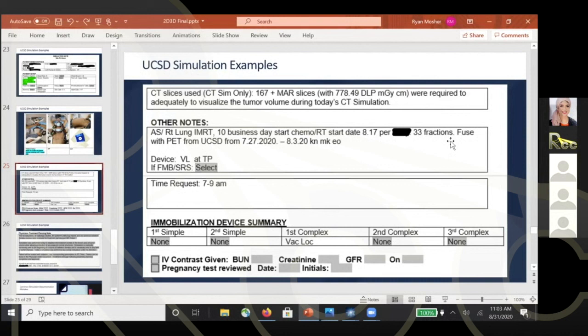So every patient that comes in for radiation treatment has to have a CT scan, unless they're an electron patient. If the patient wants, or the doctor wants to see internal anatomy, they have to have a CT scan. Oftentimes, patients will need other kinds of scans as well, and this just helps the doctors see more anatomy.